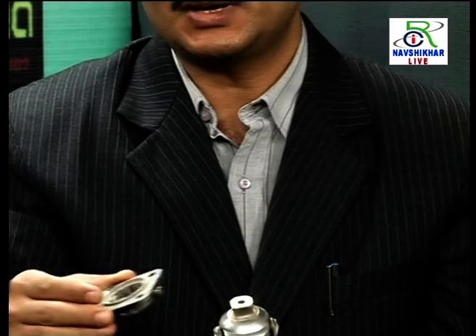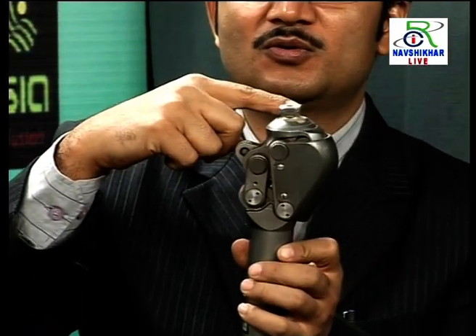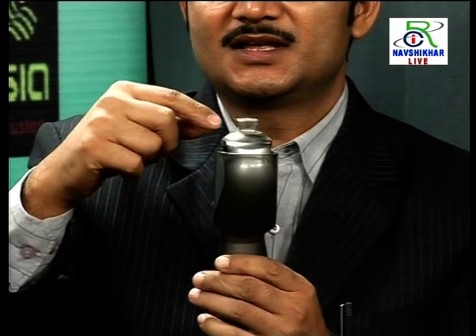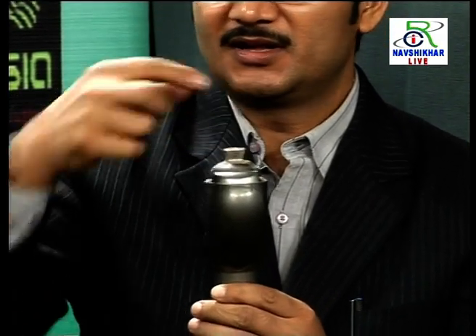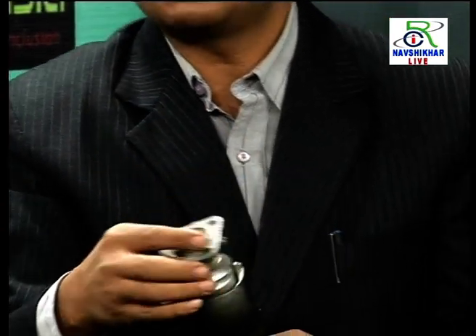But in the pyramidal system, if the four rounded corners are interchanged with a ball, then rotational possibilities are also there. So in the multiflex system, in place of the pyramidal system, we use a ball and snubber assembly, which gives rotational possibilities with a type of torsional capacity. The patient can play golf and do torsional activities. This is the basic difference between the multiflex system and the previously described dynamic response system.